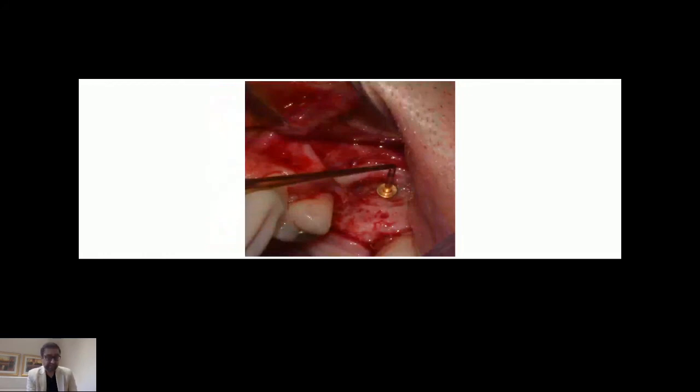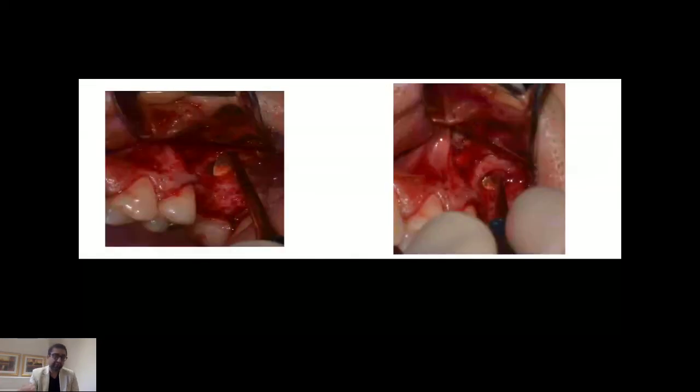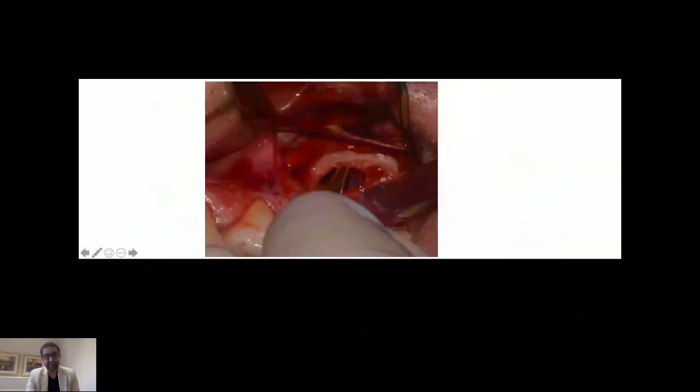These instruments are also enclosed in the same kit. So with this instrument, you can just gently push your membrane, fracture the remaining part of your very thin lateral wall now, and you can actually start pushing your membrane. With some more instruments, you can literally lift the membrane off the floor with these blunt instruments. And you have to make sure that you have lifted the membrane from all sides, the floor, the mesial, and the distal side as well. So once you've lifted that membrane, you can see the membrane has been lifted. That's the membrane, and that's the area we have created very nicely. And look at the window. It's literally an 8 millimeter window.